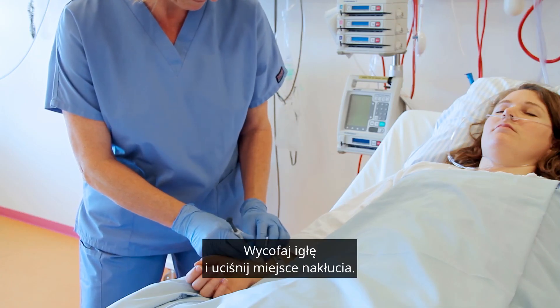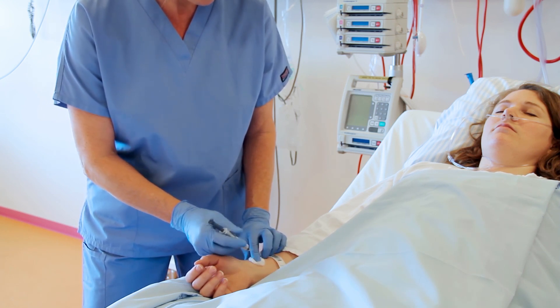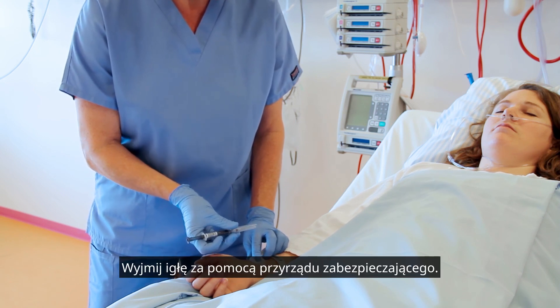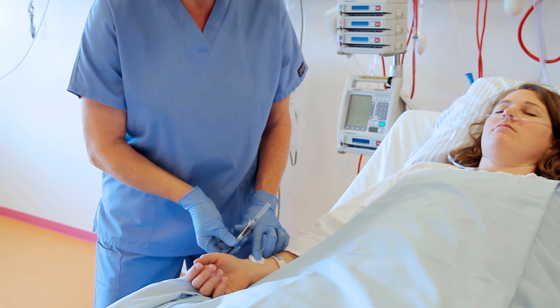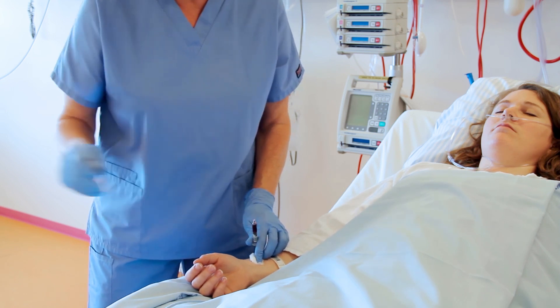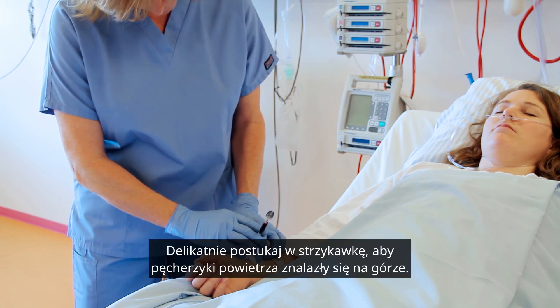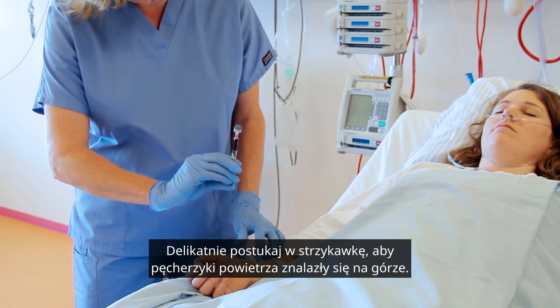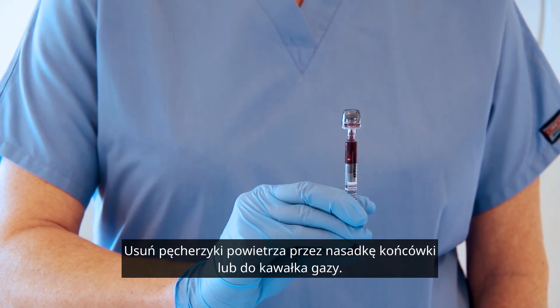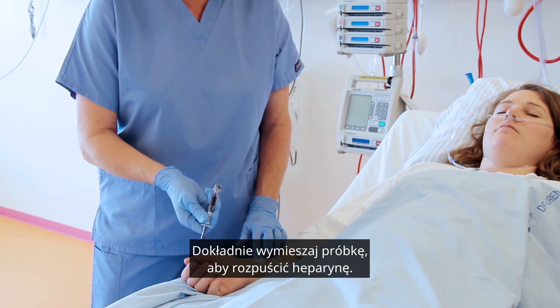Withdraw the needle and apply pressure to the puncture site. Remove the needle using a safety device. Gently tap the syringe so that air bubbles are forced to the top, and expel air bubbles through the tip cap or into a piece of gauze. Mix the sample thoroughly to dissolve the heparin.